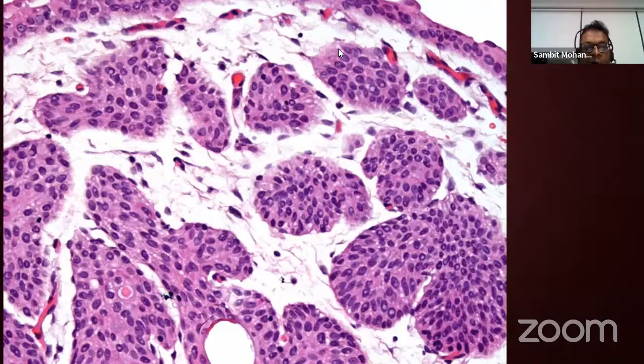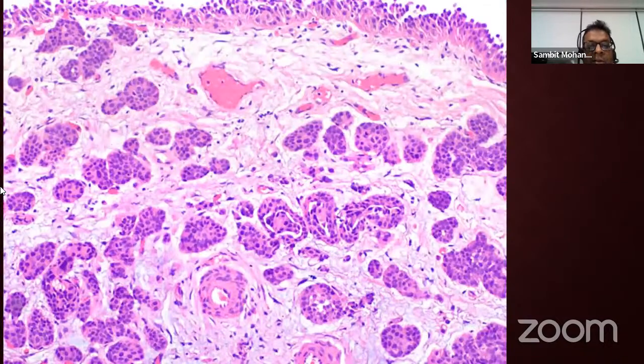And you see, we have a lot of cytoplasm in the peripheral cells, very prominent intranuclear inclusion, and you have some groups. So there is a variation in the nucleus size and shape, which is usually not present in the next picture. If I show you, for any of the trainees, any of the residents, what is this? Von Brunn's nest or nested subtype of urothelial carcinoma?